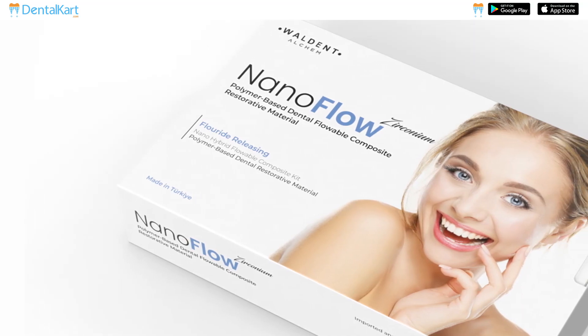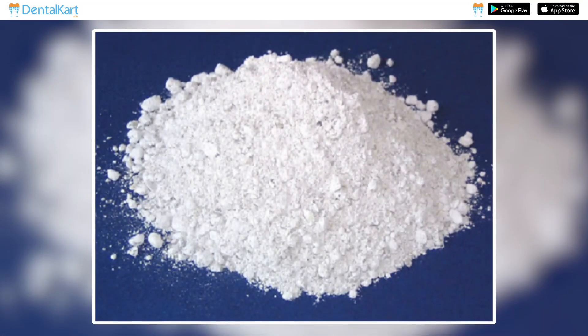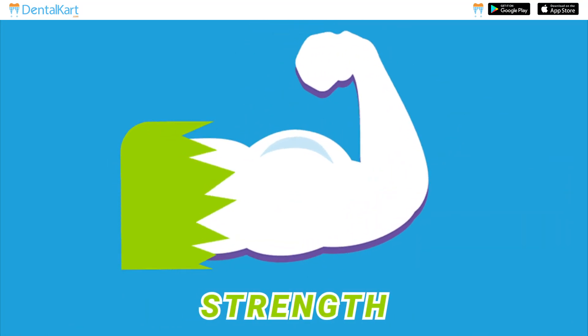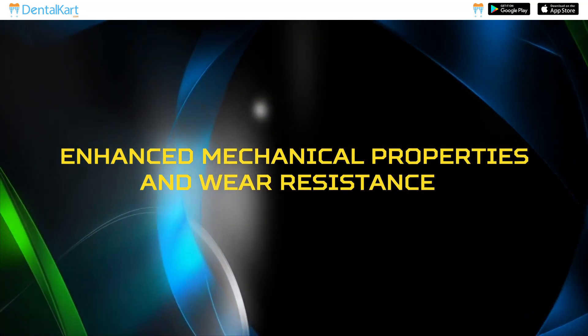The Walden Elkem Nanoflow Zirconium Flowable Composite Kit features four flowable composite syringes containing zirconium oxide that offers strength, durability, and a natural appearance with enhanced mechanical properties and wear resistance.